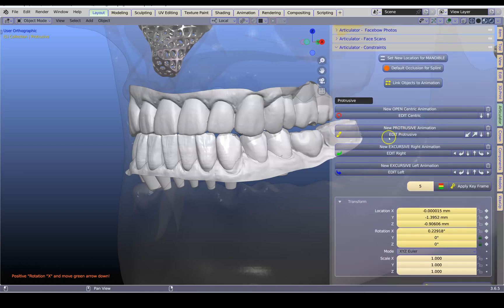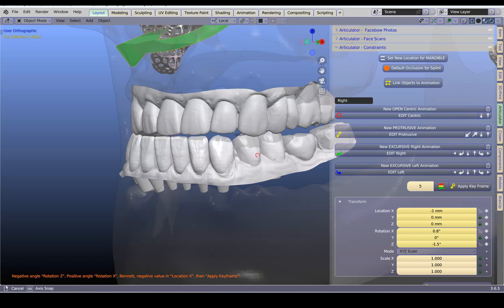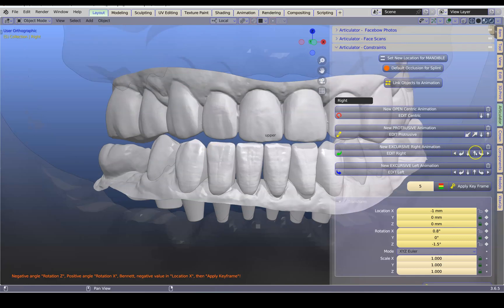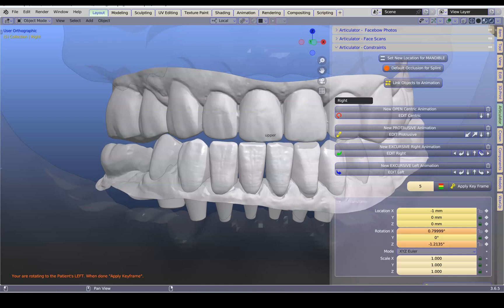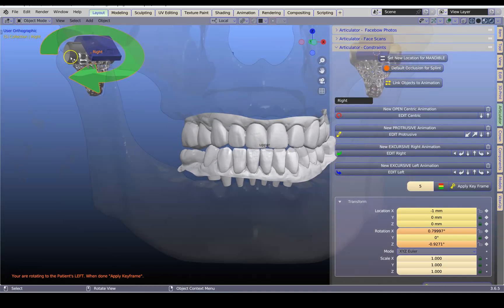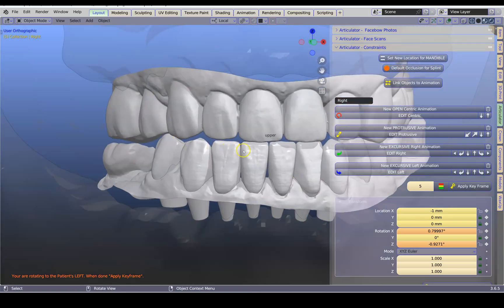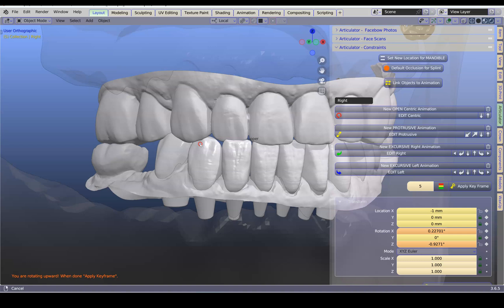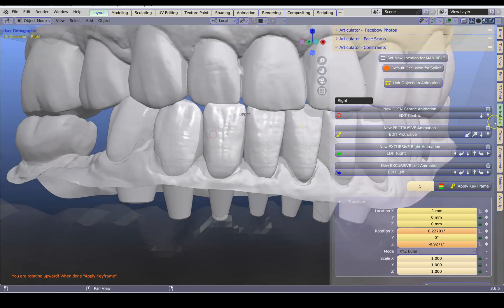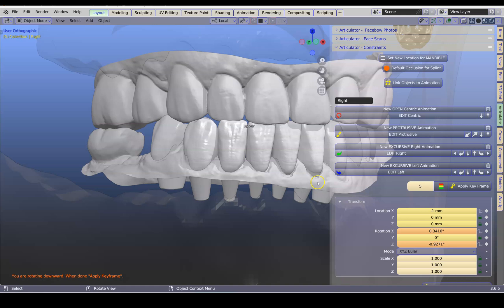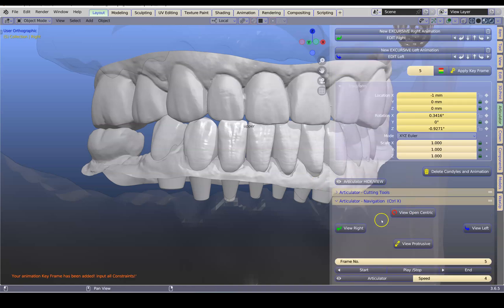Next we're going to go to the Excursive and set this jaw again using these buttons over here. This one here will put one condyle back into position while this one stays put. We've got a slight lateral movement of minus one to the left-hand side. Then we're going to close this up a little bit — basically I want to get this to intersect over here like that. The green goes for the green menu. From here we're going to apply the keyframe, and this means we can now view the right-hand side like that.